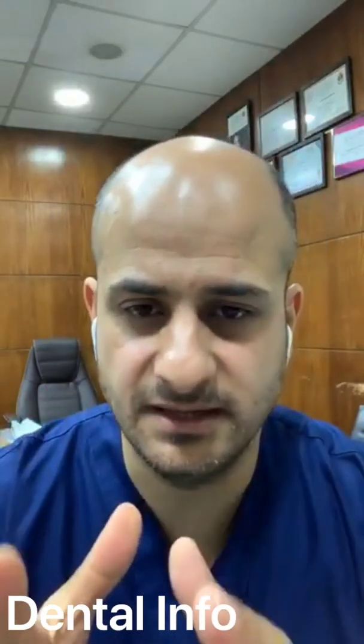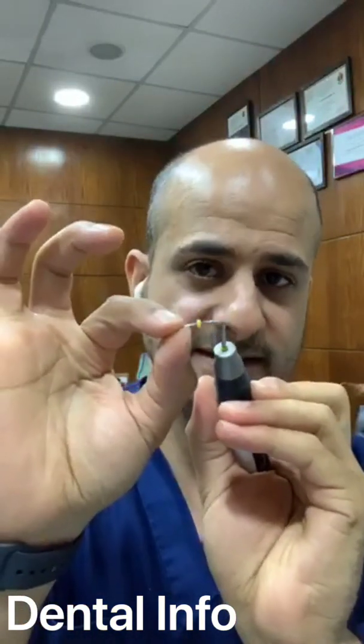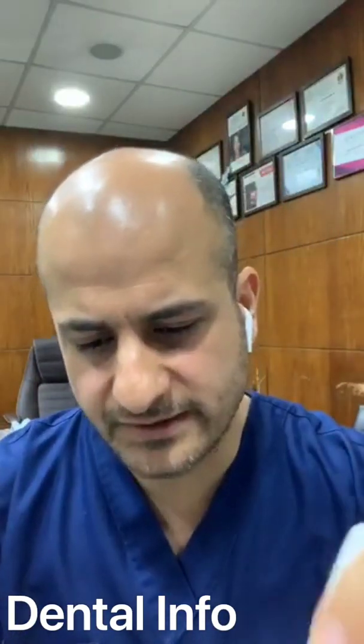How do you manage the cut of gutta-percha 3 to 5 millimeters from the apex in curved canals prepared with reduced taper? Dr. Enrico Casai, I can't quite get your question. I think I answered this in my demo. Dr. Enrico, if you have a curved canal, you have to cut up to the curve. Some people cut more by pre-curving the fast pack tip and trying to go farther with the curve, but I don't recommend this. In this situation, you have to cut up to the curve.